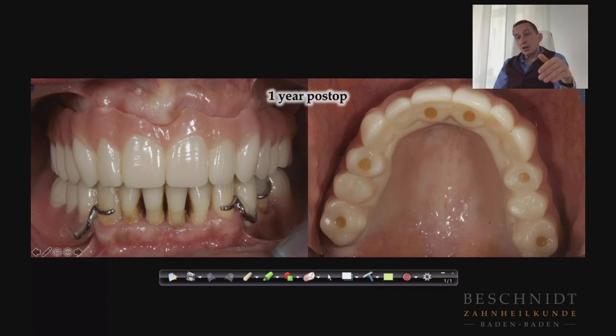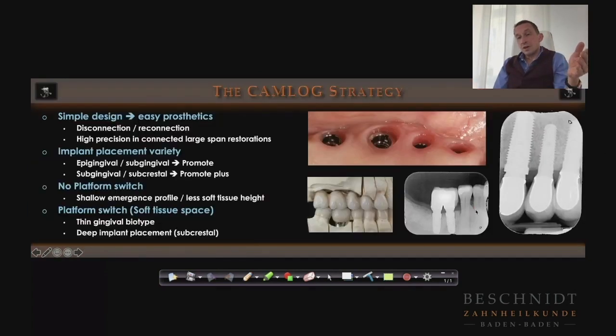At 1 year, you take off the bridge and you can just do the impression for the next one.